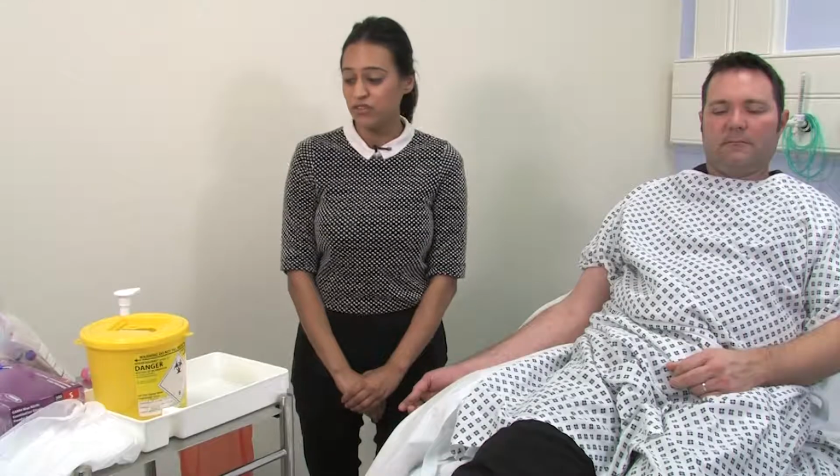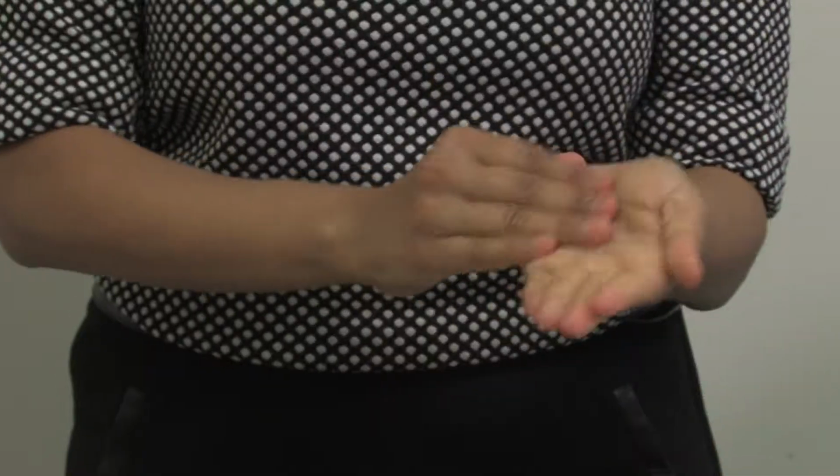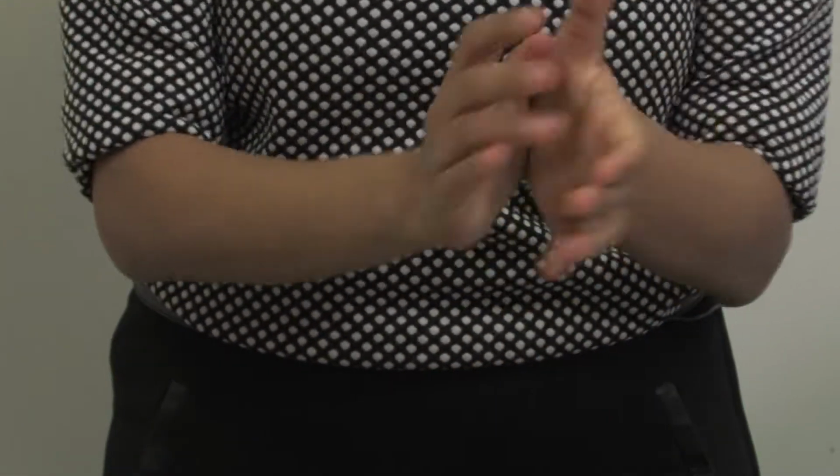The first step is to wash our hands. It's important that we use the 7-step hand washing technique and that we use this technique every time we decontaminate our hands in the hospital setting.